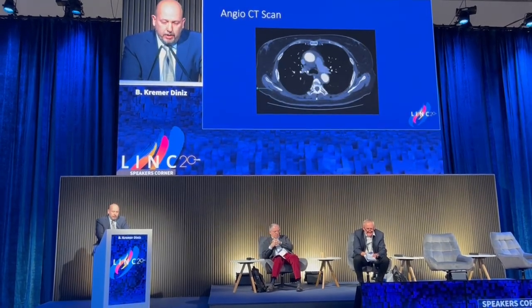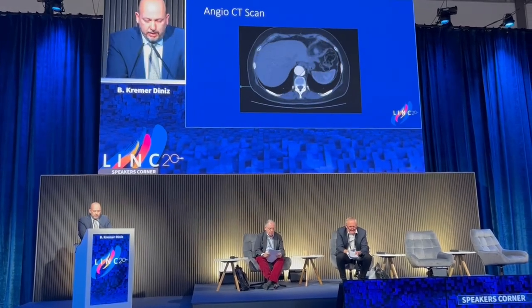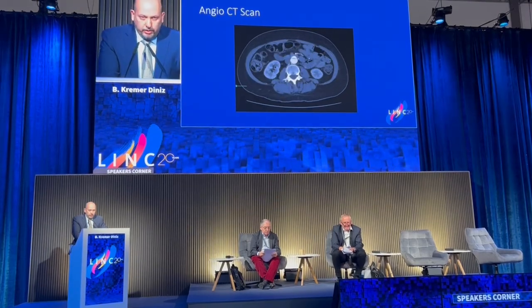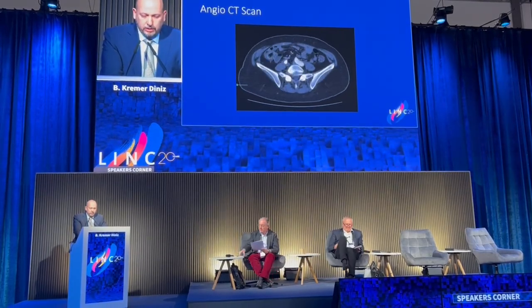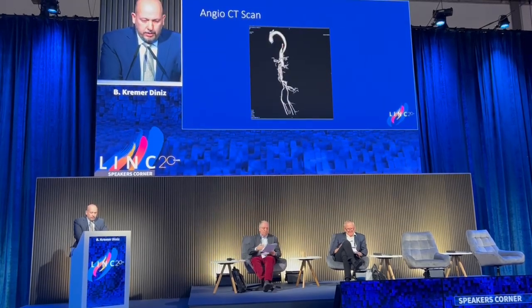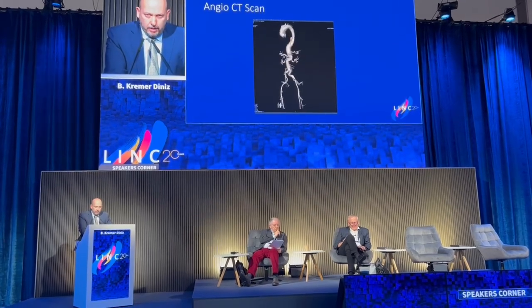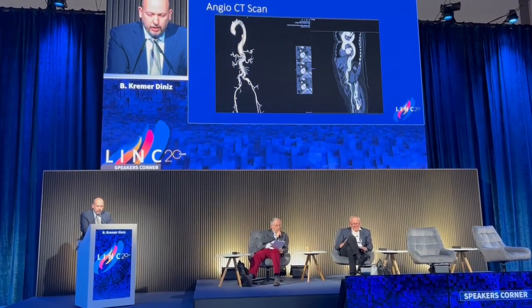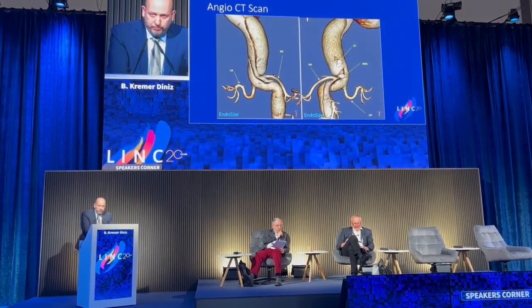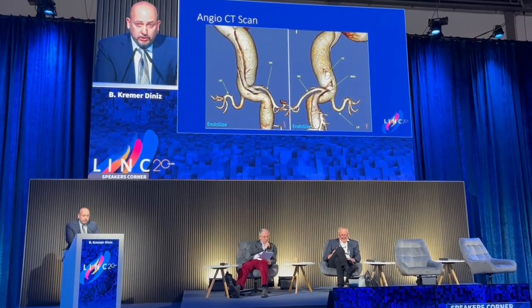Here's the angiogram that confirms the diagnosis, and here you can see a type B aortic dissection. At this point, very tight in the true lumen and more than one entry, and the dissection goes through the left iliac. Here's the tomography. You can see a kink in the abdominal aorta, very complex anatomy. And the patient still had back pain and some leg pains after 48 hours.